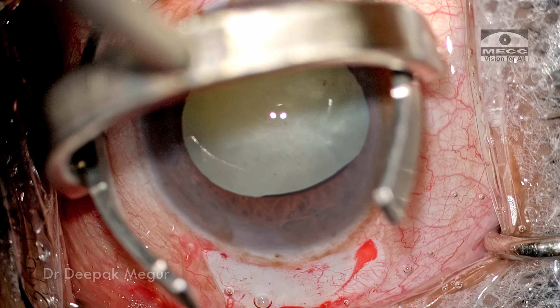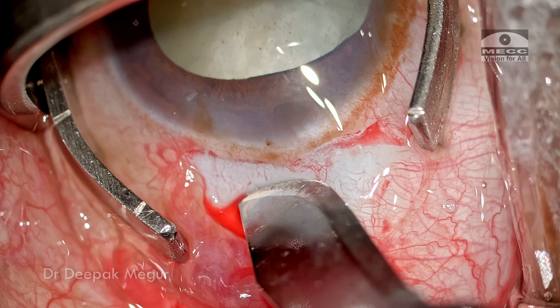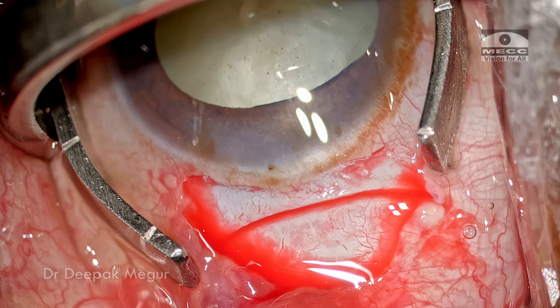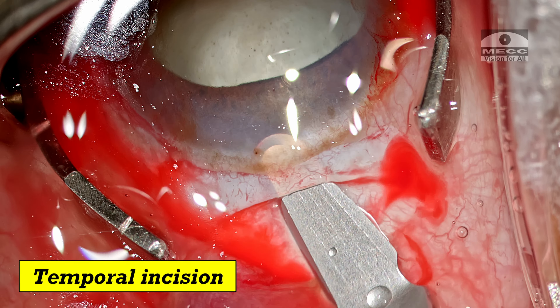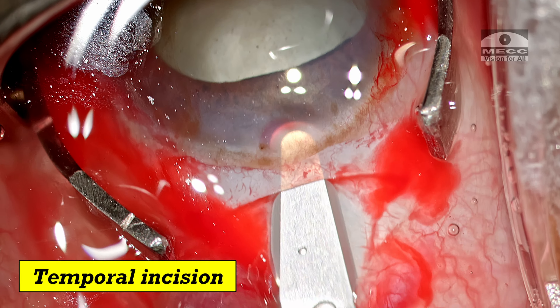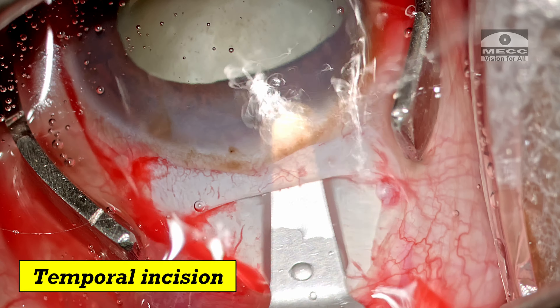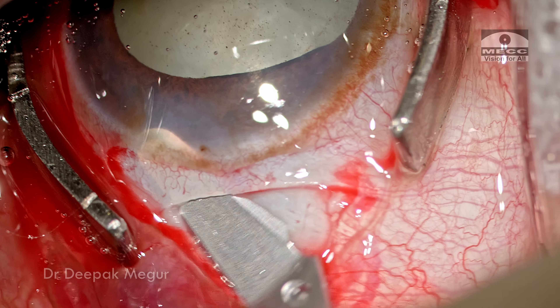I'm using a fixation ring to stabilize the globe, and an external frown-shaped scleral incision is being made. The scleral groove is about 1.5 millimeters from the limbus in the central part, and the sclero-corneal tunnel is measuring about 5.5 to 6 millimeters in length.